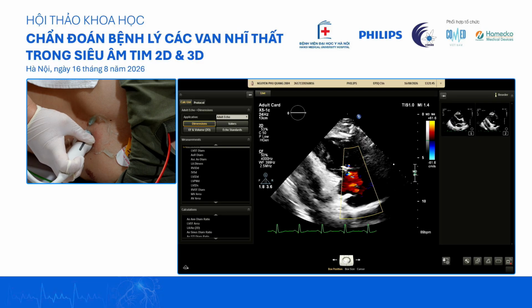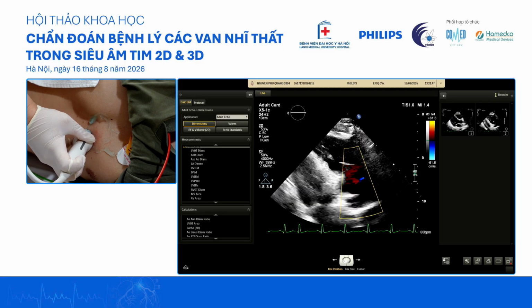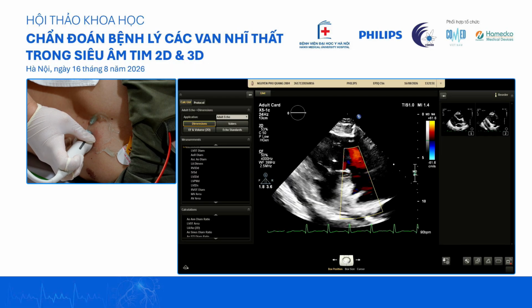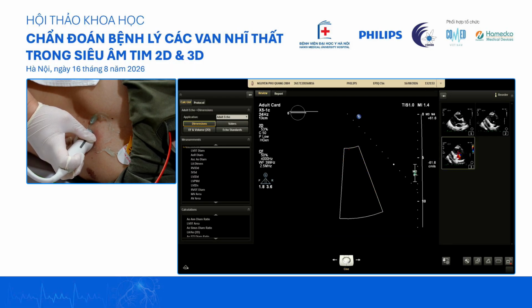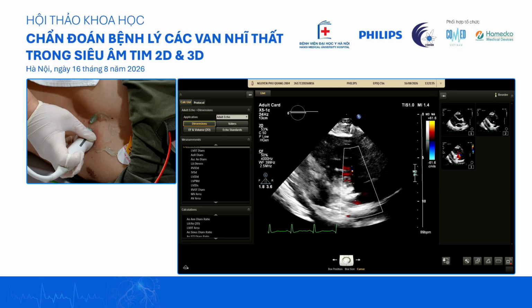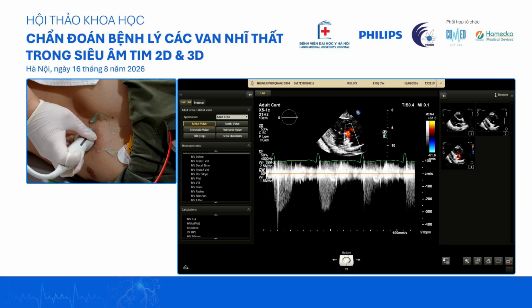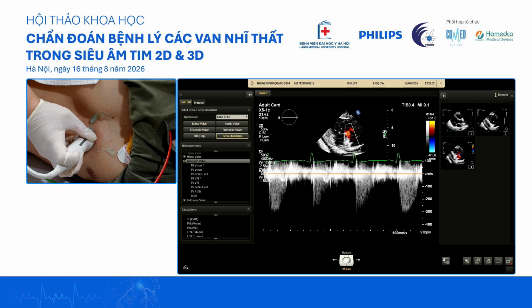We can see that there is some regurgitation. Let's take a continuous wave Doppler. We can estimate the PASP. It's almost 3 meters per second for the continuous wave Doppler of the tricuspid valve.